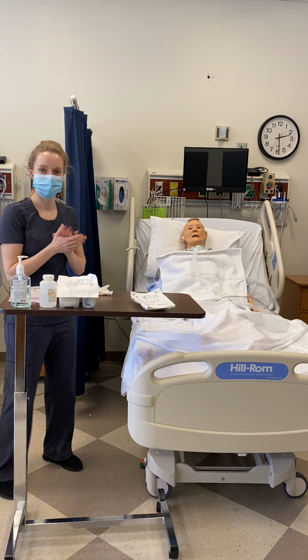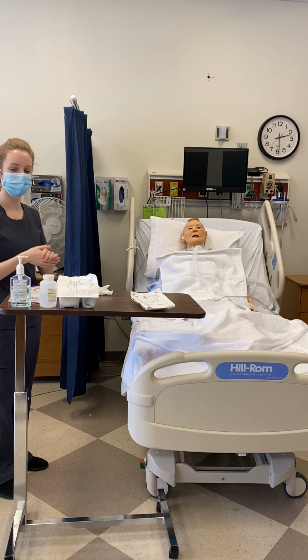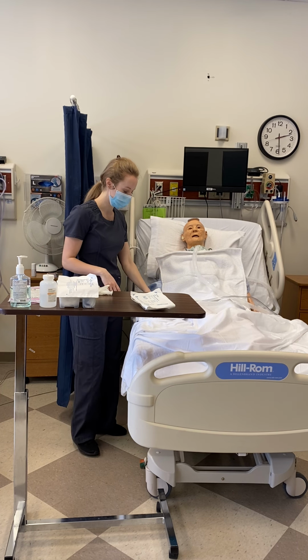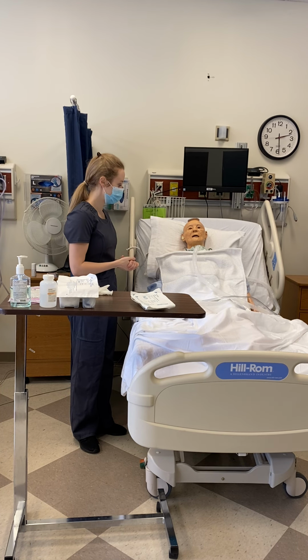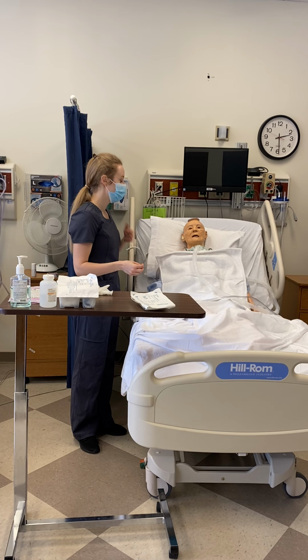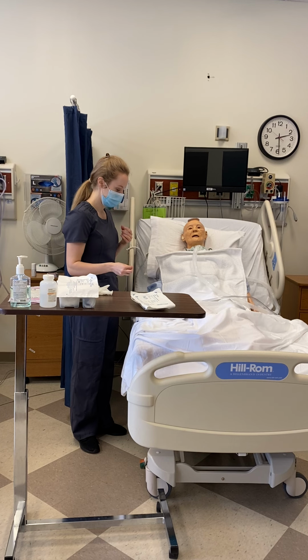I'm knocking and introducing myself. My name is Grace. I'll be your nurse today. Hand hygiene, client privacy, and verifying my client. Mr. Smith, I'm going to be suctioning the secretions out of your nose and tracheostomy today and then getting a clean bandage on there, okay?